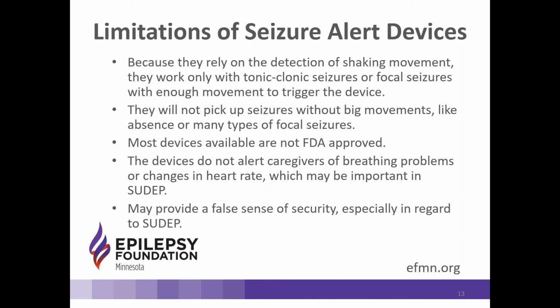Most of these devices are not FDA approved. That doesn't mean there's anything dangerous about them. It just means that they are not approved as medical devices by the FDA. These devices do not alert caregivers of breathing problems or changes in heart rate. And that's something that may be important in SUDEP because some of the research that has been done points to the possibility that issues with breathing or heart rate may be involved in some cases of SUDEP. And these devices, for the most part, do not detect those things.